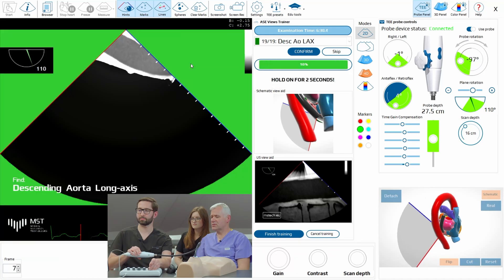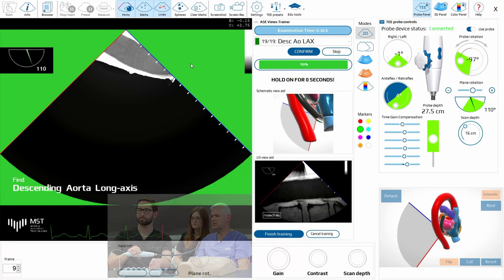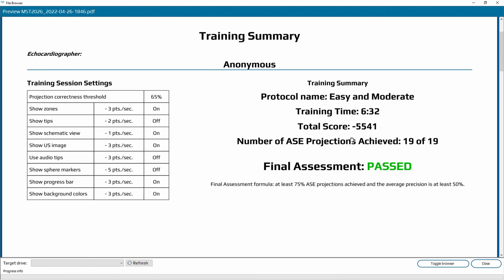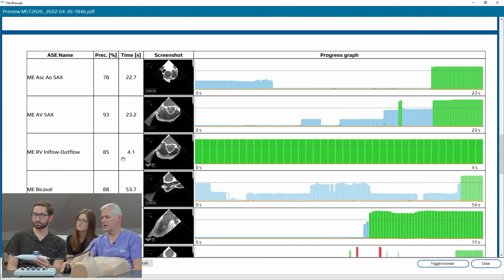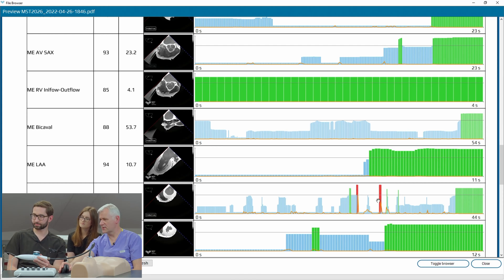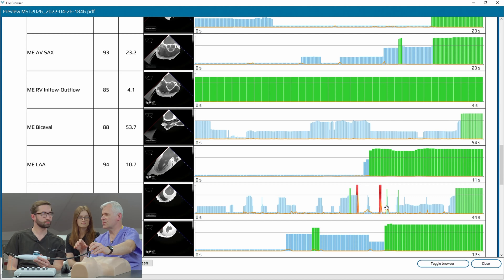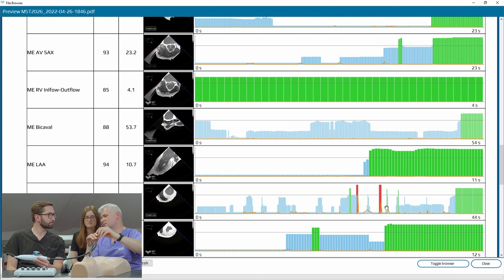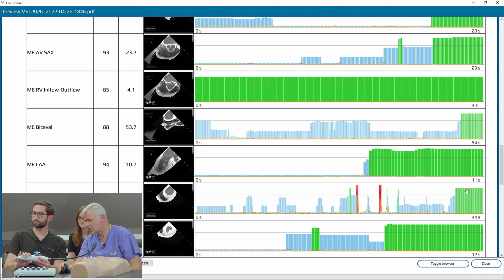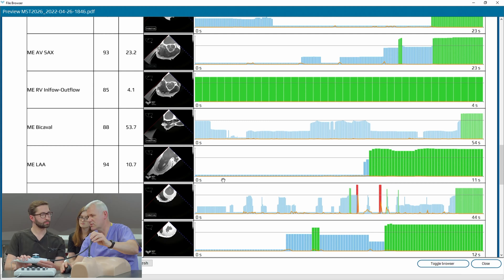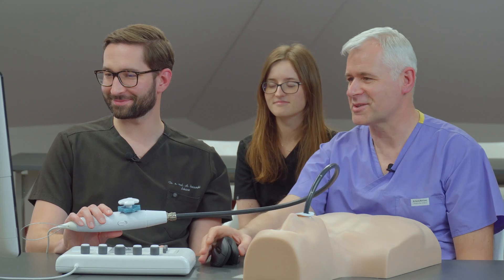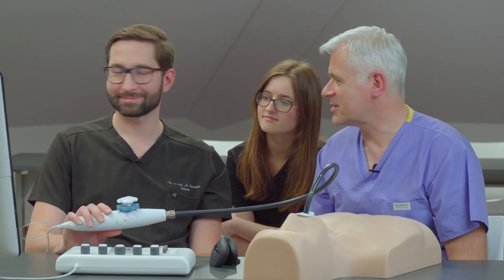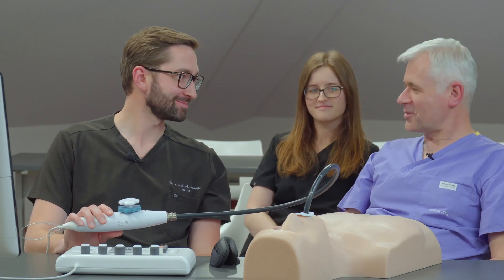This is view number 19 and you did it in a very short time — let's see the result. You passed, congratulations! Six minutes for the whole test and very nice trajectories, very short times. This orange line gives us an idea how rapid your motions were. When you do the study you should be very slow, because rapid motions usually mean you may damage something. So this orange line should be almost completely flat. This is a very good result — congratulations, because you passed. And this is your first full TEE examination. Thank you very much, it was a pleasure. Good luck.